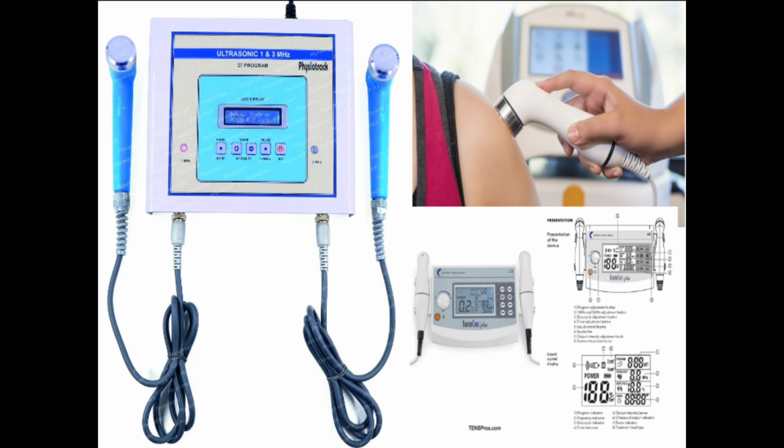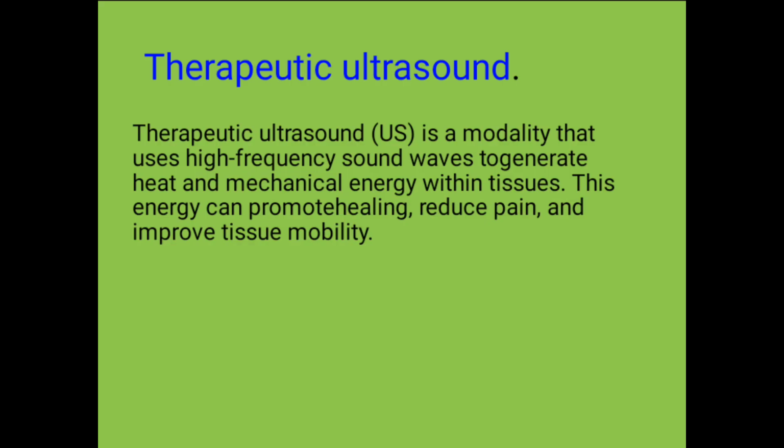Now we need to understand what therapeutic ultrasound is, and when I say that, that will take us to the definition of therapeutic ultrasound. So therapeutic ultrasound is just a modality that uses high frequency sound waves to generate heat and mechanical energy within tissues.